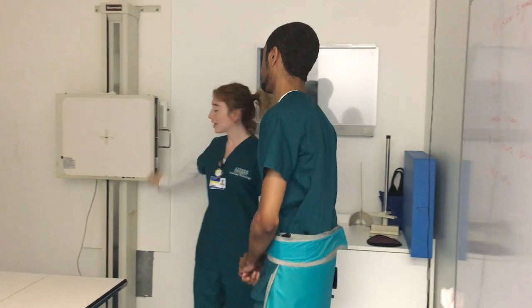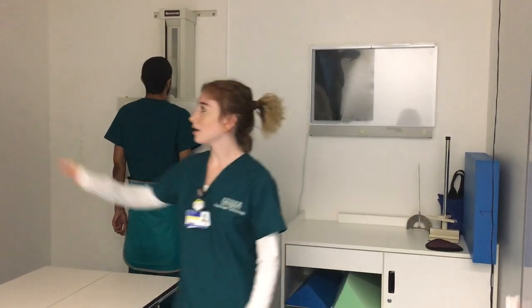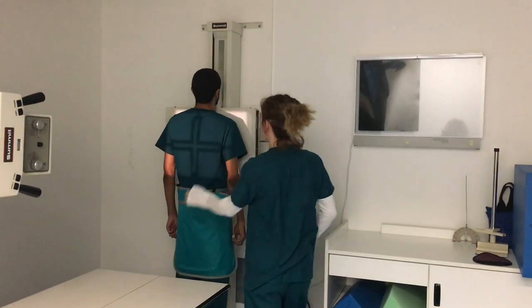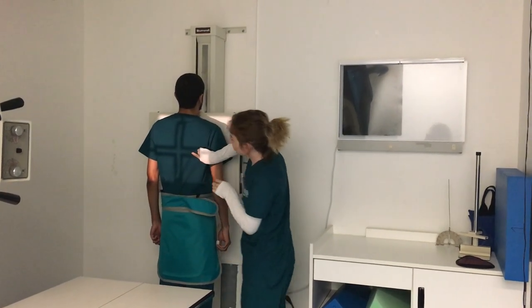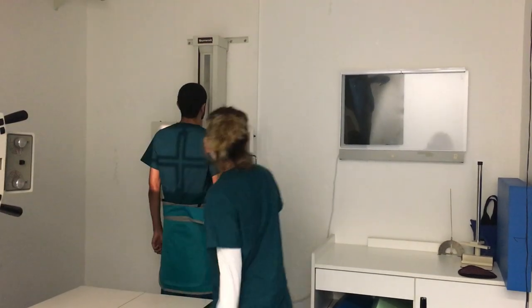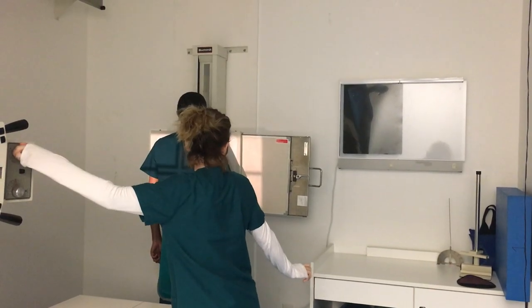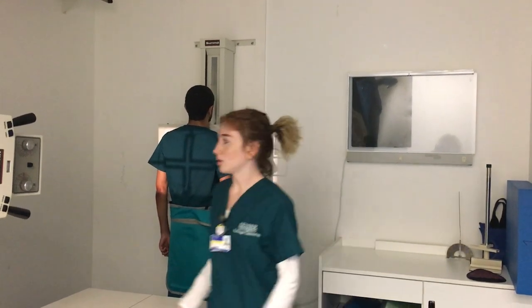I will now have you come over and put your chest up against the board. And I will bring the tube down and center it to where I think it is. I will then feel for the scapula and the inferior angle, and that is at the level of T7, which is the middle of the patient's body. And then make sure that it is centered to the image receptor, which it is. And collimate the patient's chest.